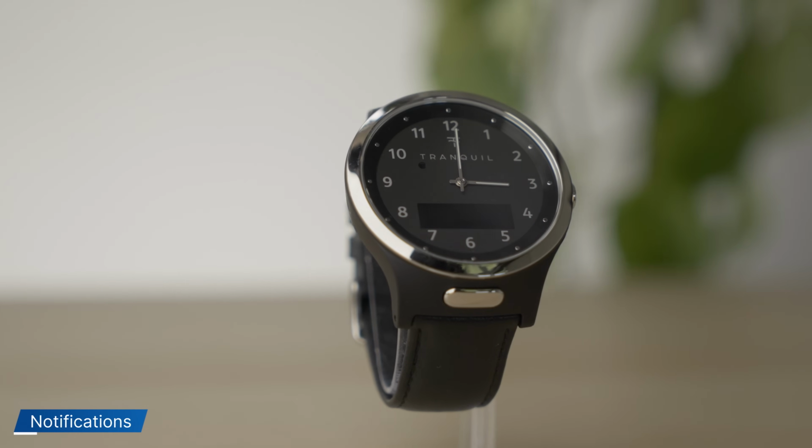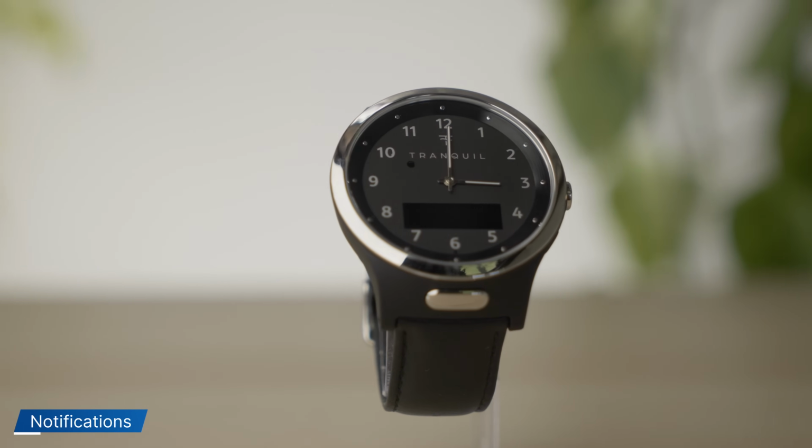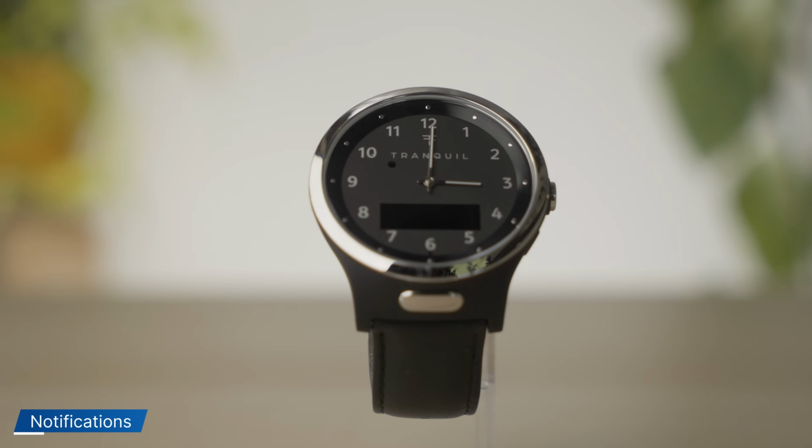So let's talk about notifications or alerts from the watch. So you can be alerted in 3 different ways, and that is phone calls, emails, or app notifications. What's great about the phone calls is what I just demonstrated for the SOS button is also applicable for notifications. So for example, you could set it so that when your dad leaves home, you get a phone call, but first of all, it calls you, and then it calls your sister, and then it calls your brother. And if I wasn't to answer, or I didn't press that button on my keypad, it moves to the next one and the next one.